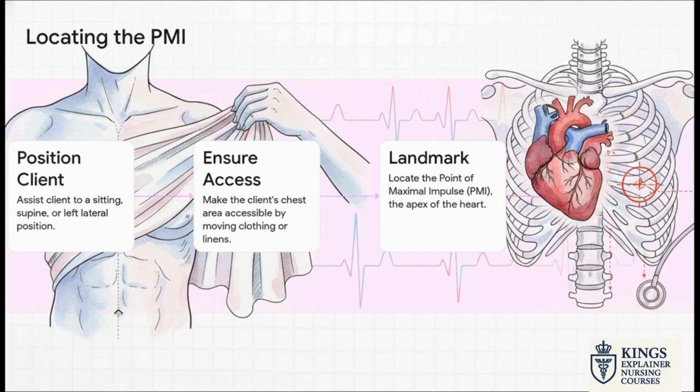Then you've got to find that sweet spot, the point of maximal impulse, or PMI. For most adults, you'll find it by going down to the 5th intercostal space and then moving over to the left midclavicular line. This is your target. It's where you'll hear that heartbeat the loudest and the clearest.